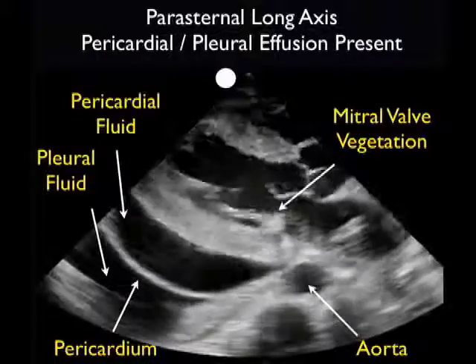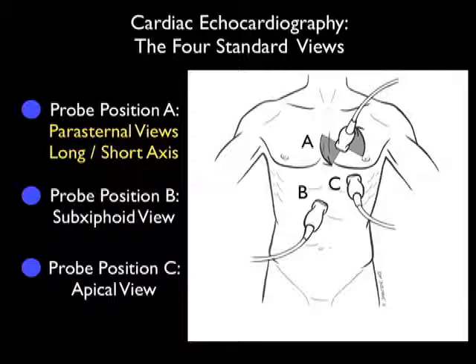In conclusion, the parasternal long axis view of the heart gives a great deal of information about our patient's condition and can be instrumental in emergency care. Through this module, I hope now that you'll have a better idea on how to grade left ventricular contractility as good through poor. Also, to be able to identify the presence of a pericardial effusion.